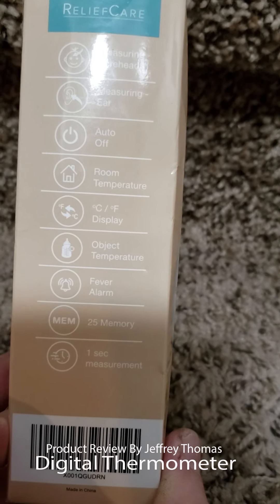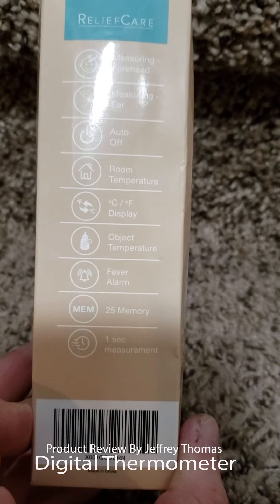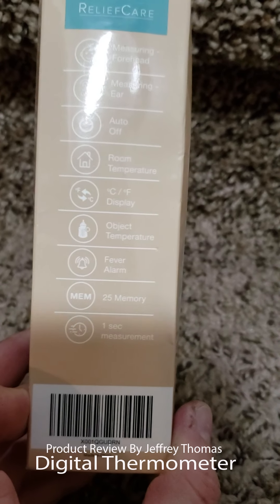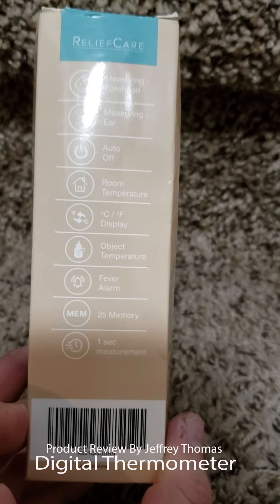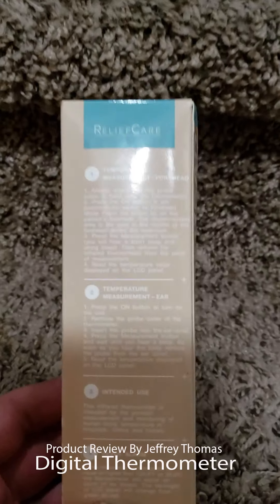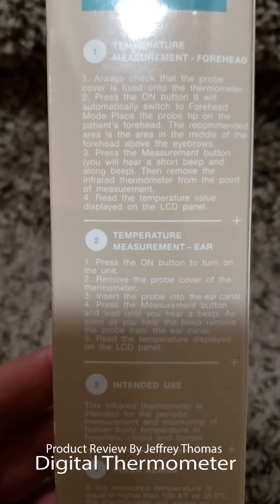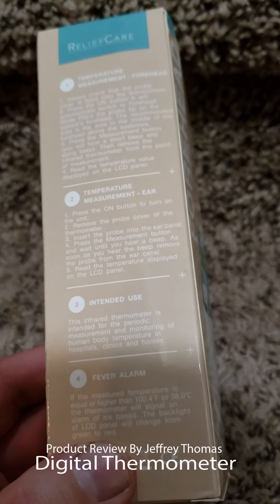It does object temperature and has a fever alarm — it will actually alarm and turn red when a fever is detected. The last 25 temperatures you take will save in memory, and it reads temperature in about one second for the ear or the forehead. Here are the instructions for doing that.